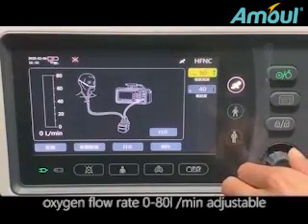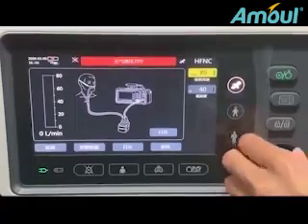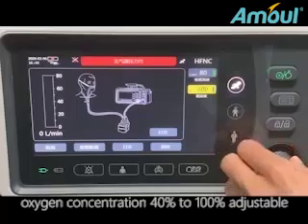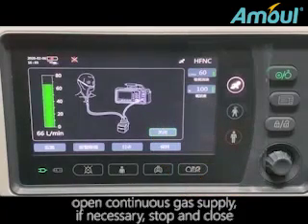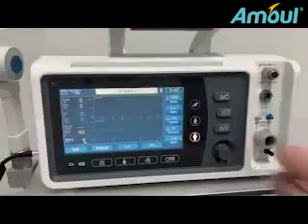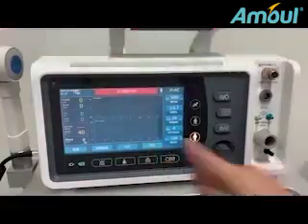Oxygen flow rate, 0 to 80 liters per minute adjustable. Oxygen concentration, 40% to 100% adjustable. Open for continuous gas supply. If necessary, stop and close. Hold: hold time to inhale or exhale.